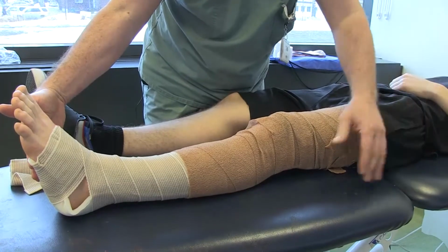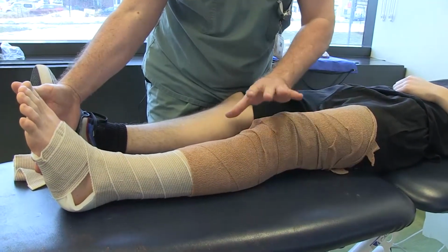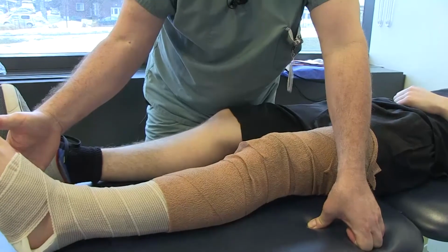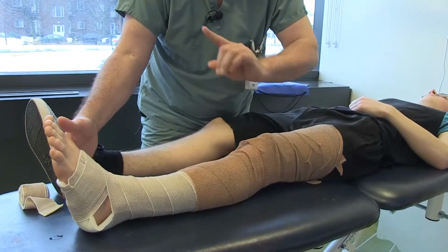So if we're able to slide the brace underneath the buttock, that's a way of making sure the leg will stay straight, and that makes a big difference in the patient's comfort. A femur which is not in torsion will generate much less pain than a femur which can be in torsion.